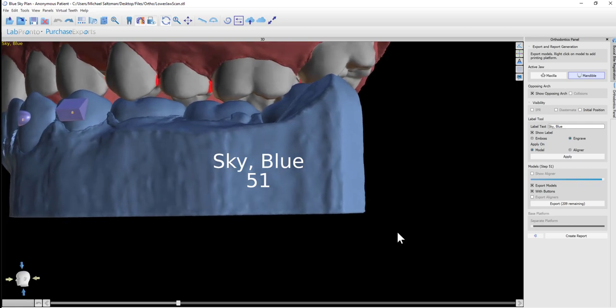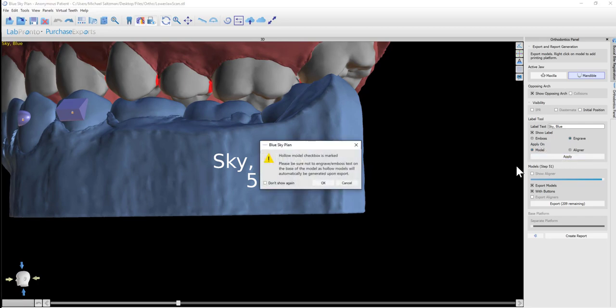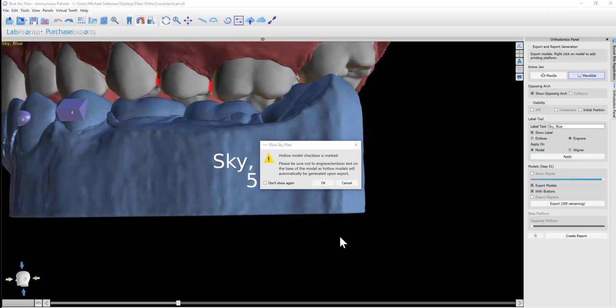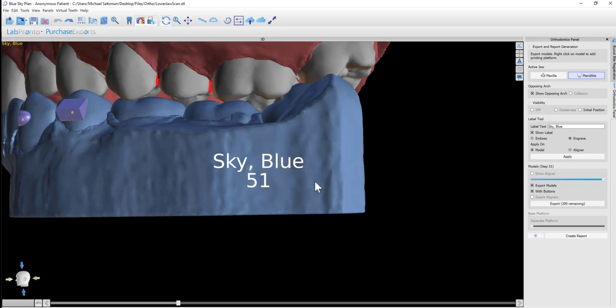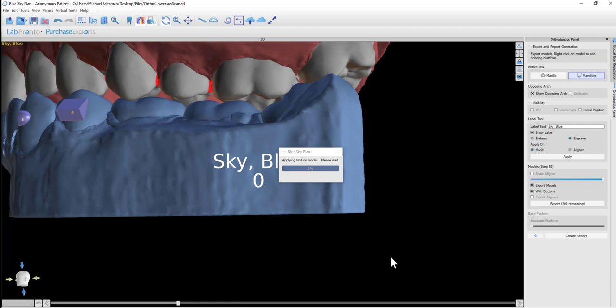Once we position everything, we could click the Apply button. The message that comes up on the screen is just telling us that the models are going to be printed hollow, so nothing should be embossed or engraved on the base or bottom of the model.